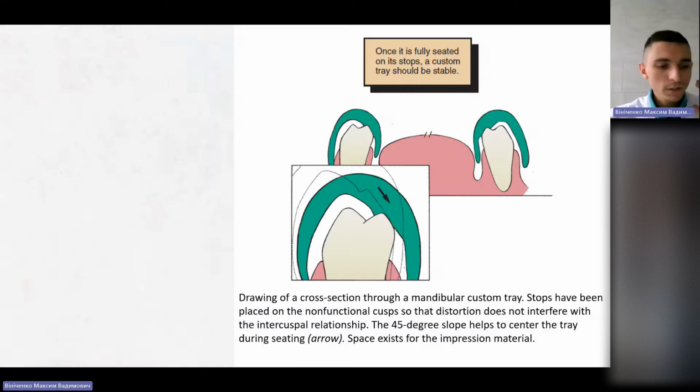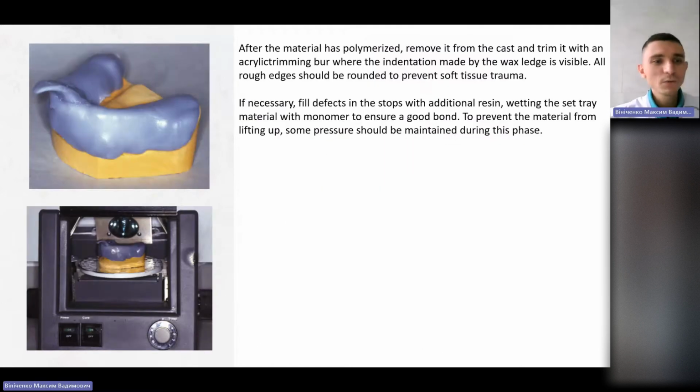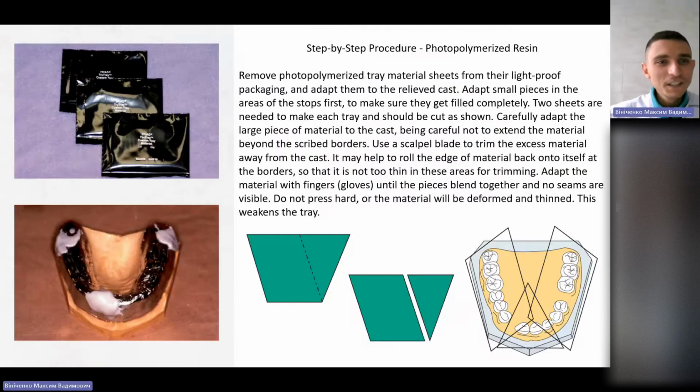As in orthodontic appliances, 95% are made by the laboratory. Nowadays, the doctors don't want to make this. They want to give the impression to the laboratory and have it ready to go. They don't want to make this.